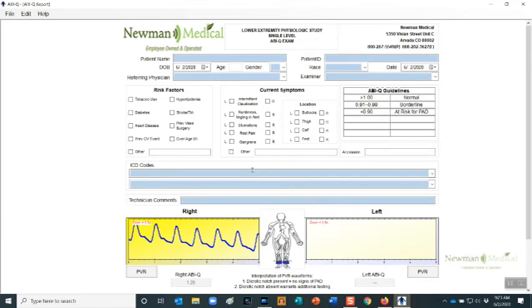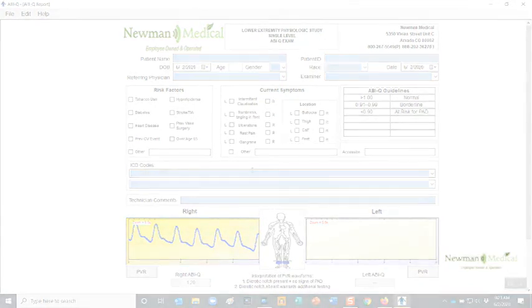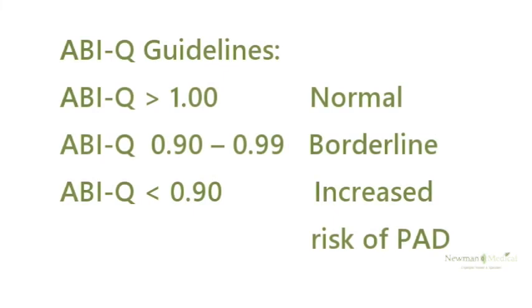Under each waveform will be the calculated ABIQ. ABIQ greater than 1.00 indicates normal. ABIQ between 0.90 and 0.99 indicates borderline risk of PAD. ABIQ less than 0.9 indicates increased risk of PAD.